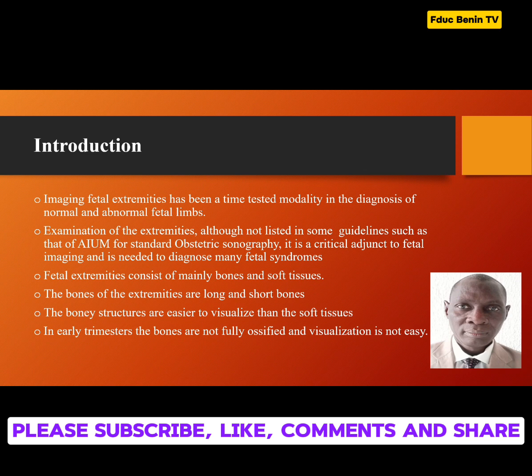Fetal extremities consist mainly of bones and soft tissues. We have long bones as well as short bones. And the bony structures are easier to visualize than the soft tissue with the ultrasound. In early trimester, the bones are not fully ossified, and visualization of the fetal bones at that phase of fetal life is not easy.